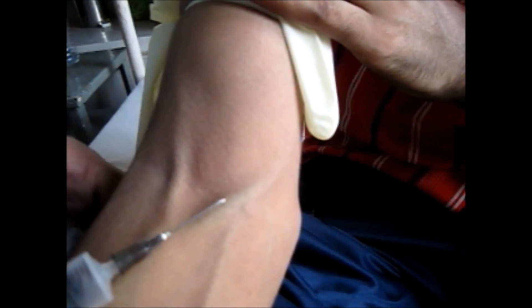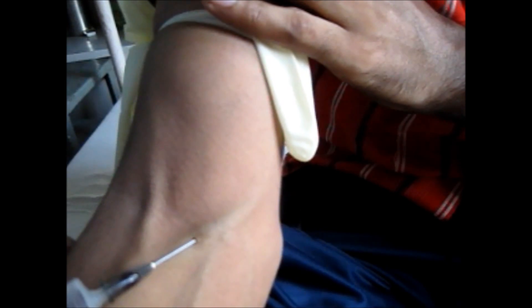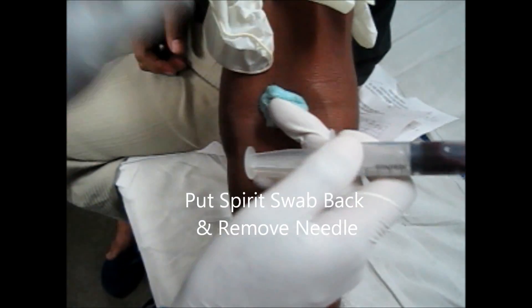Now, do not try to recap the needle because it can lead to needle-stick injuries. Now, remove the tourniquet that you have tied, and this way you can take the sample.